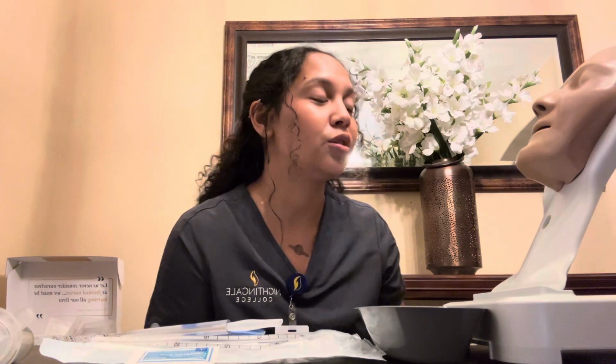Today we got an order to place an NG tube just so we can do your enteral feeding, just so you can get all the nutrients that you need, okay? Does that sound good? Tina says yes. Okay, so we're going to go ahead and proceed.